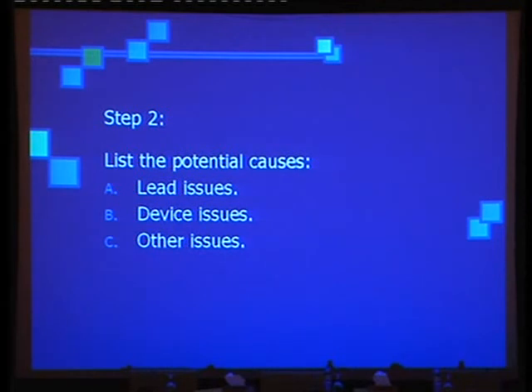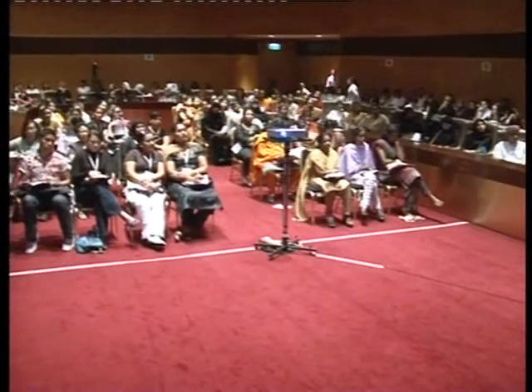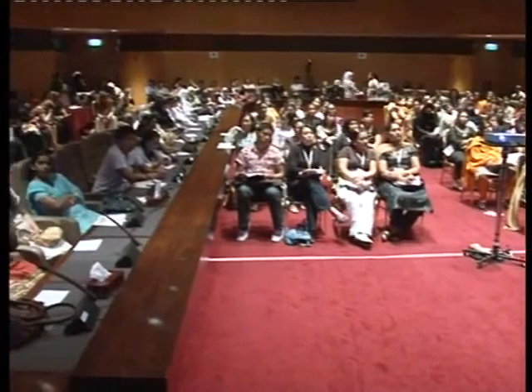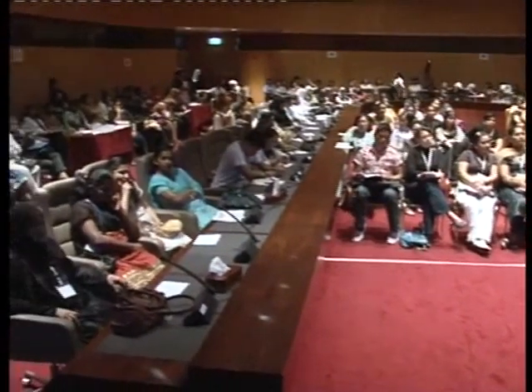Other issue, medications. All of you working in the critical areas of cardiology know the problems of the medications. Amiodarone, sotalol, flecainide, all of these increase the threshold. Besides that, some medications can reduce the threshold, like isoprel, atropine, epinephrine. So you should also look for electrolyte imbalance. Is the patient hyperkalemic, hypokalemic? Be aware of this. It is very important before you come to the conclusion that the pacemaker does not work.